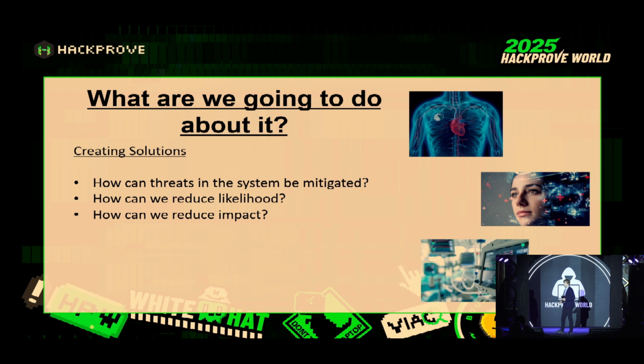Similarly, we can look at the impact. So we'll need to probably look at a little bit of a different example. But we're looking at a problem where someone can use default credentials to access the database on a device. And we look inside that database and we see a whole bunch of PHI, patient health records, sensitive information, date of birth, social security number, whatever it is. That's a pretty bad finding.